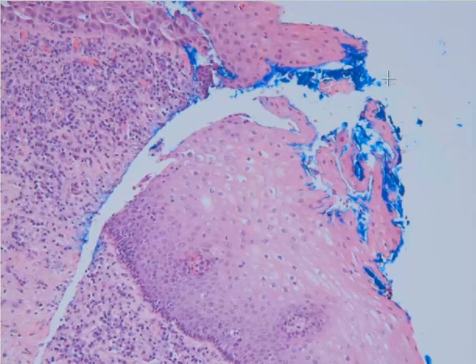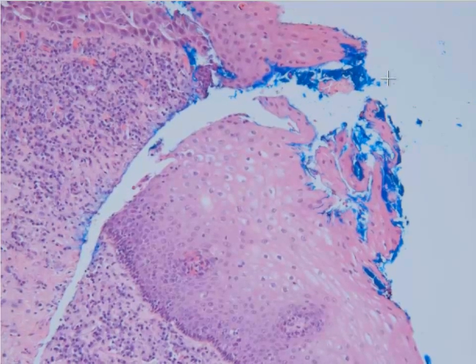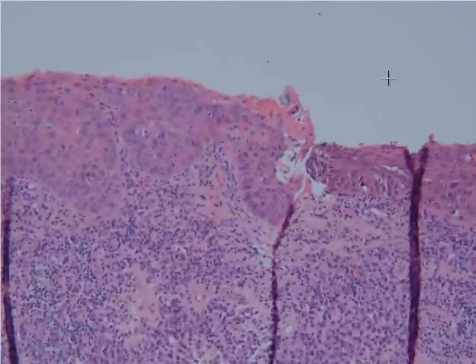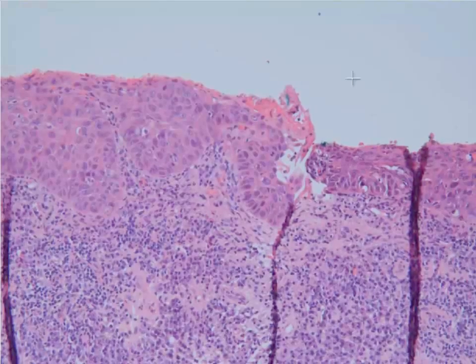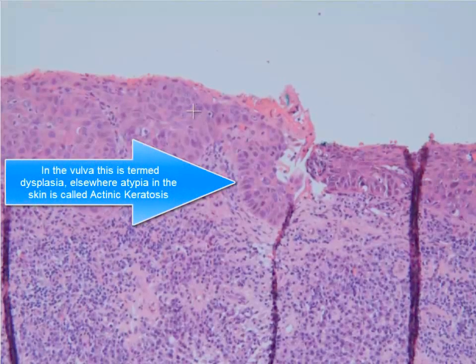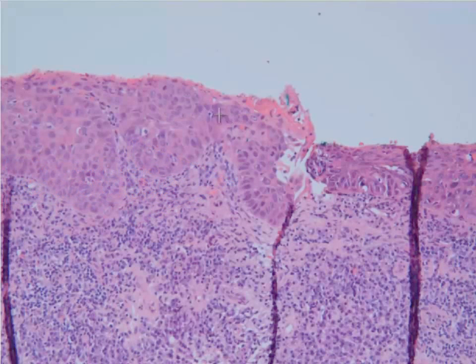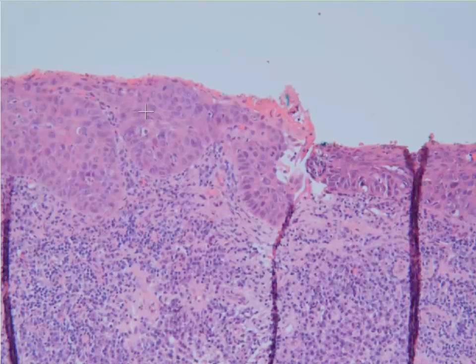You can see a little blue ink that we use to mark the edge of the specimen. Moving towards the tumor, you'll see a little bit of atypia. This is actually vulvar skin, so this is what we would call dysplasia. Actinic change is similar to that in non-mucosal skin — if you had a squamous cell on your arm, you might see actinic change related to sun exposure or other contributing factors.